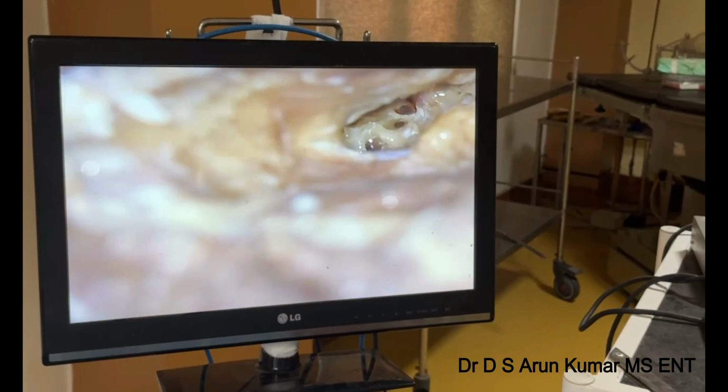In cases where you are unable to expose the round window, you can do cochleostomy and insert the electrodes. Either in round window or cochleostomy, we will insert the electrodes into the scala tympani of the cochlea.